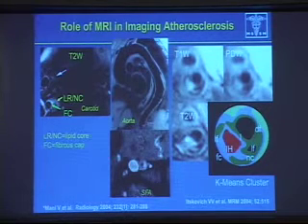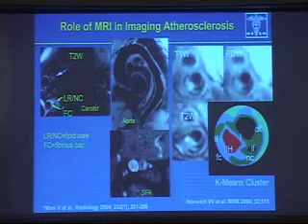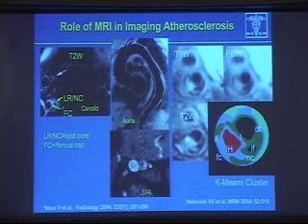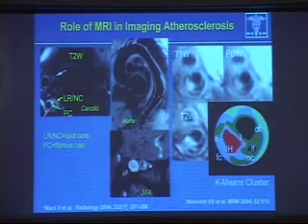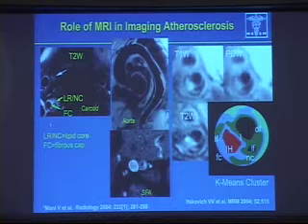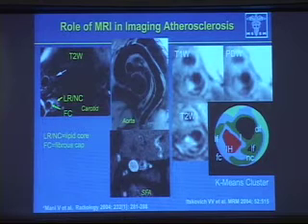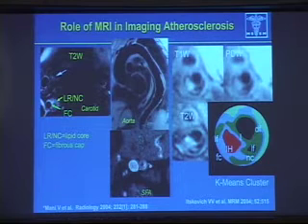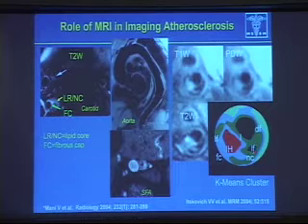But today we do have MRI available, strong, in multiple centers, able to look at the whole aorta. You can see the whole aorta in a single shot here, looking at plaque accumulation within the wall at different areas. You could do plaque characterization with non-contrast-enhanced MRI in the carotid artery and the peripheral vessels, and get this non-invasive pathology. This is where you can get a map of the thrombus, the lipid-rich necrotic core, dense fibrous tissue, et cetera.